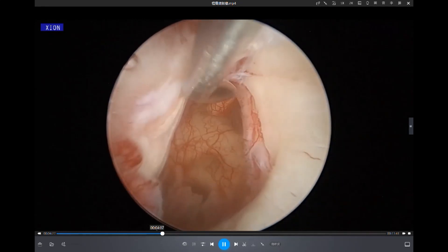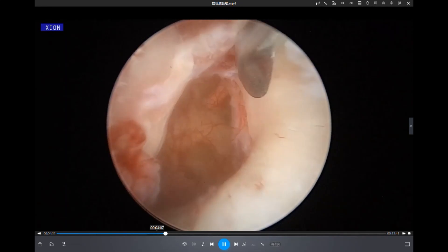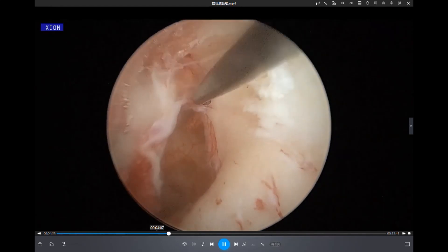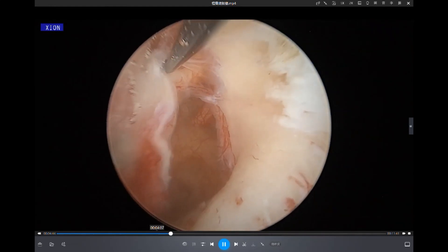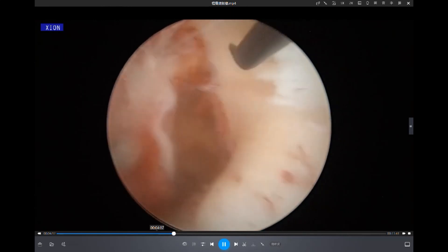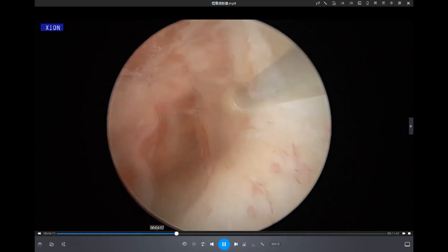You can see the incudostapedial joint with dislocation — that is the reason he had really severe conductive hearing loss. In order to gain more space for further inspection, we have to drill out some bone on the scutum.